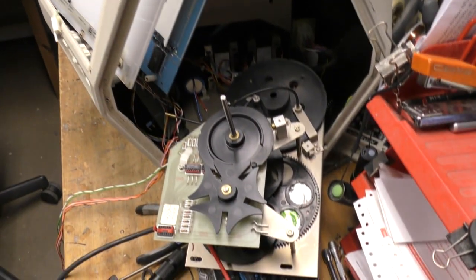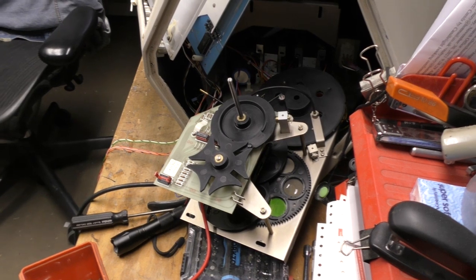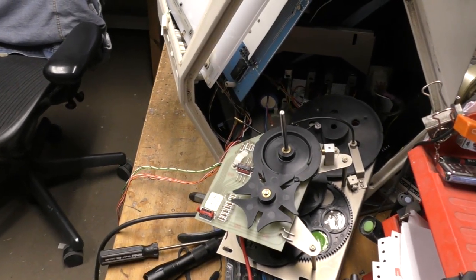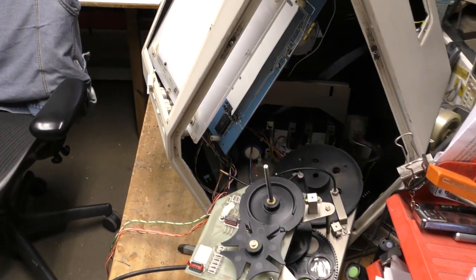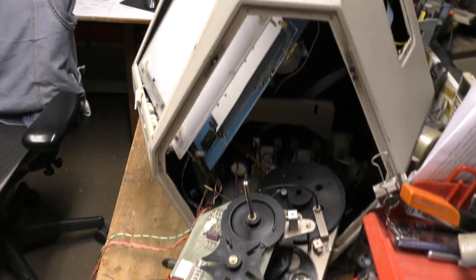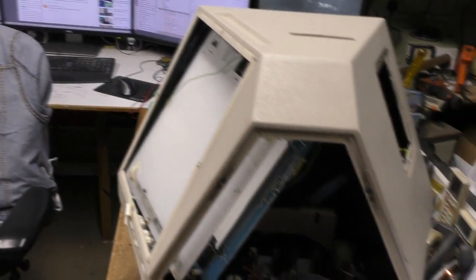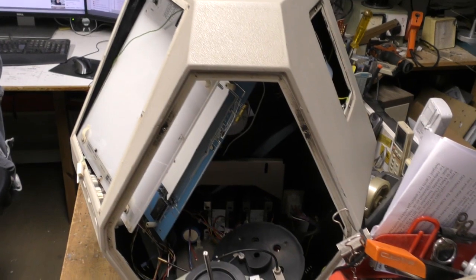But still, this thing must have cost a fairly sizable amount of money in its day. I'm guessing the design dates back to perhaps the late 70s. Certainly the board construction looks fairly typical for that time for small volume products. This case looks like it's fiberglass, and one of the annoyances was that the internal assembly was bigger than this aperture, so there were screws that were really hard to get to.